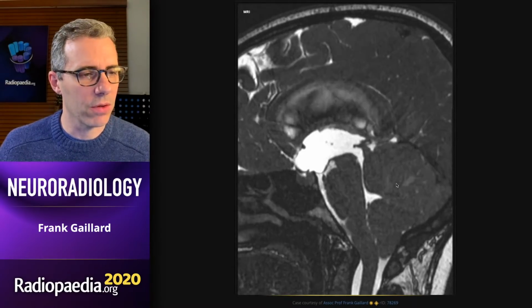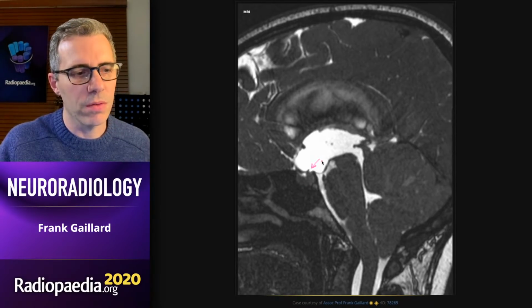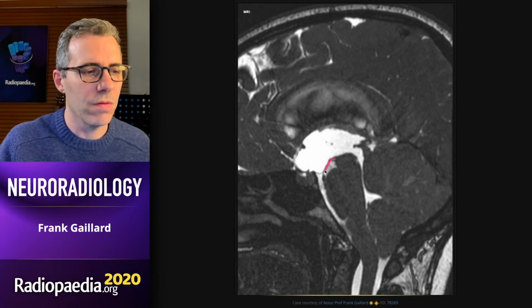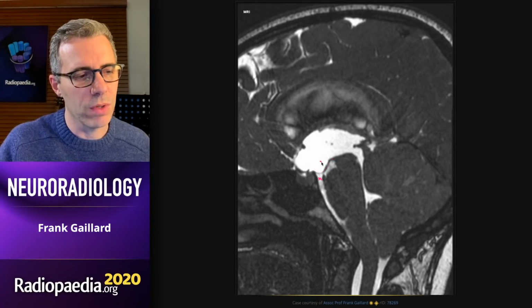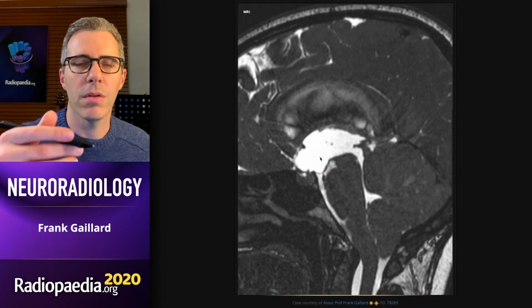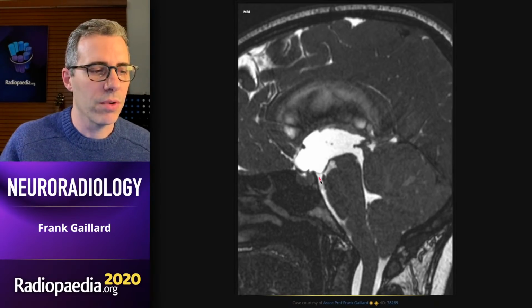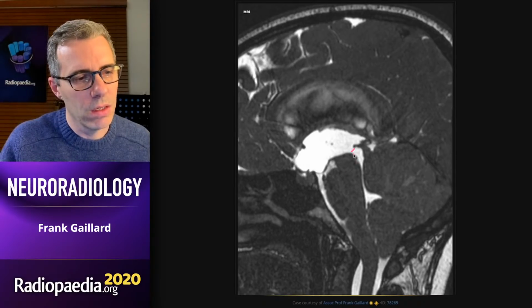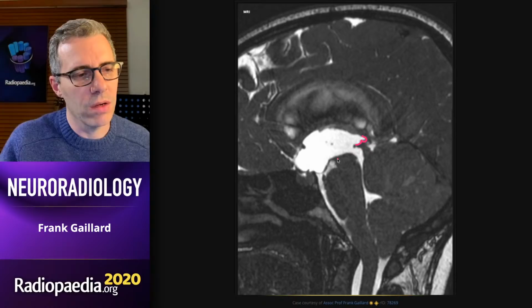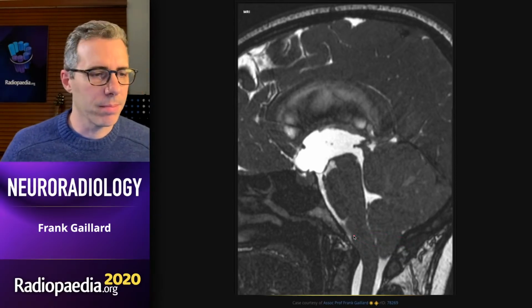We can have some beautiful anatomy here on thin T2, which shows that wonderful inferior bowing of the third ventricle into the supraoptic recess, the infundibular recess, the floor of third. Notice how the third ventricle, the beak of the bloody hummingbird, is depressed. And this is a very good sign that there is a pressure difference between here and here. So this is acute third ventricular hypertension. No one uses that term, but the pressure inside the third ventricle has to be higher than the pressure in the interpeduncular cistern, or otherwise that floor of the third ventricle wouldn't be displaced. And we have widening and funneling of the aqueduct, and we've got widening of the pineal recess, and down into the fourth, and then we've got obstruction at foramen magnum.